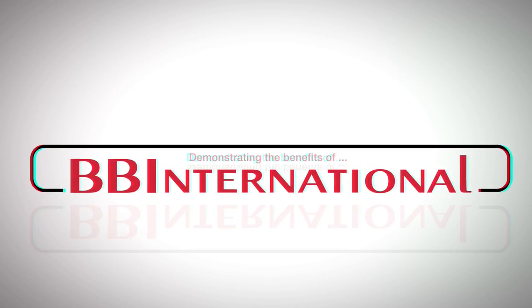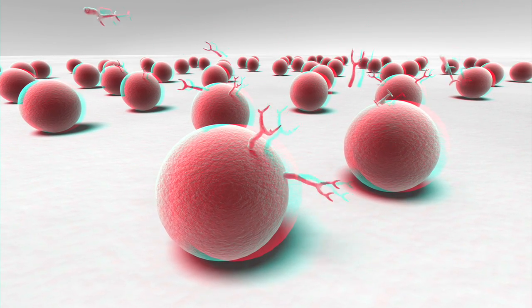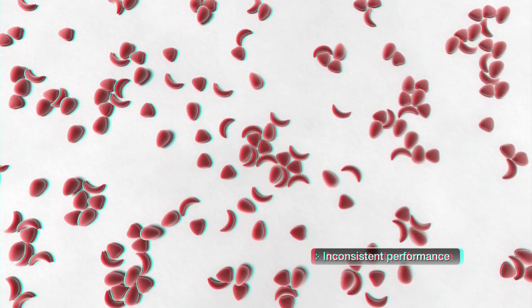BB International's manufacturing technique allows the production of large batches of gold to a high level of reproducibility of size, dispersion, and shape. This ensures a firm foundation for conjugation and the peace of mind that your rapid assay will provide reliable results. This is not the case for all gold colloids.